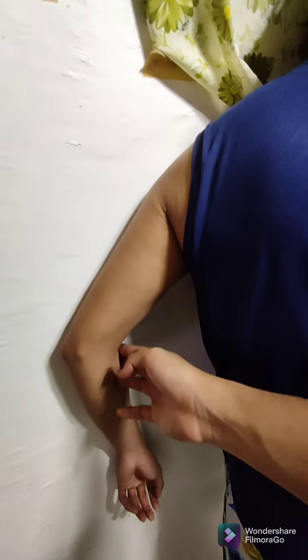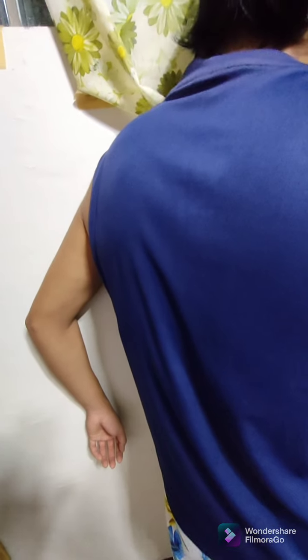And then, if acromion or coracoid process naman, dito naman siya. The patient's limb, the left limb, is situated dito ba sa likod niya, abducted slightly. So with this position, this best demonstrates the acromion, and the coracoid process, which is situated dito banda. And also, don't forget the IR. So since gagamit din tayo ng grid, assuming na lang na nalagay ko na dyan with this corresponding marker.